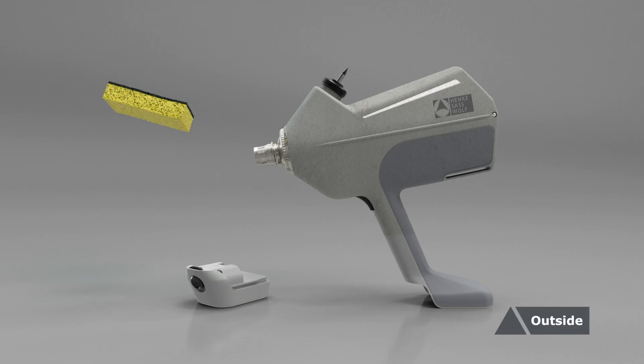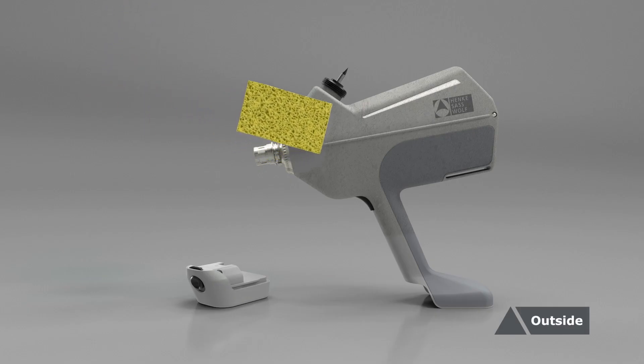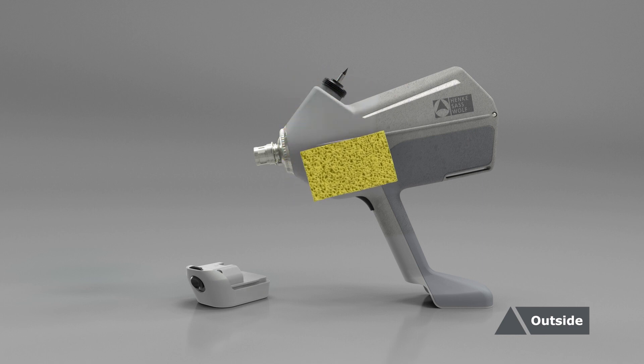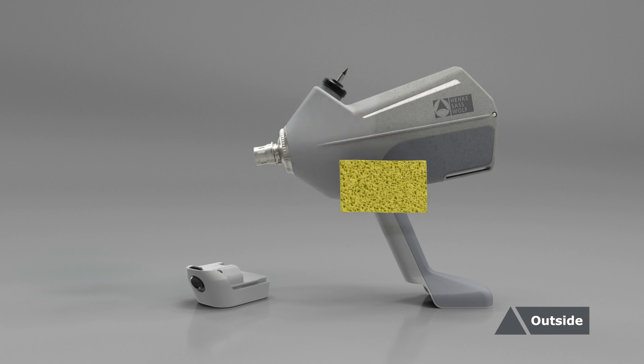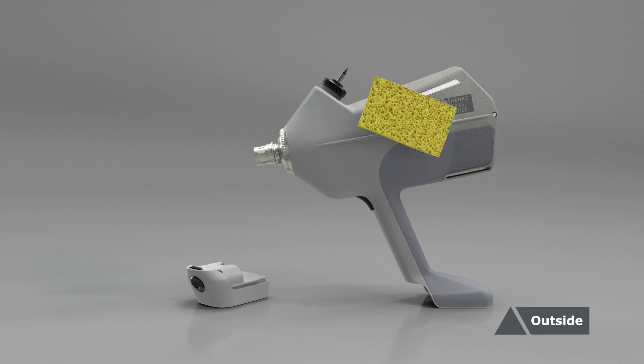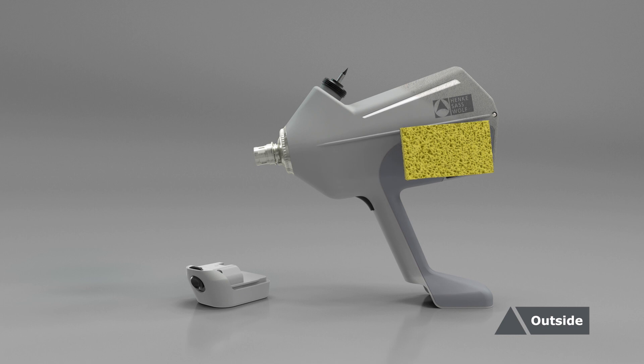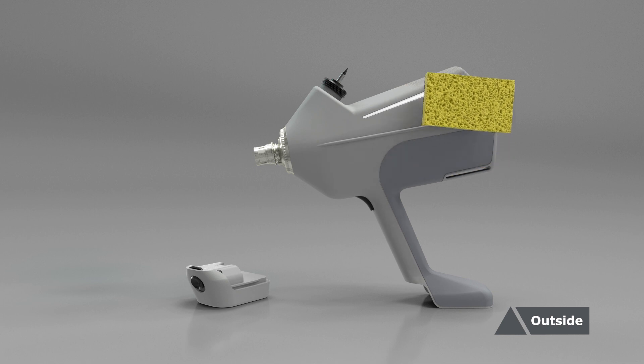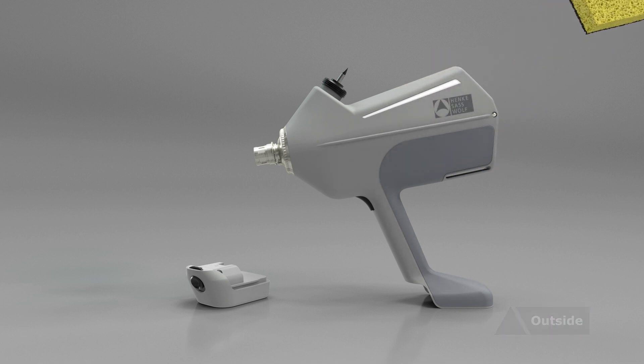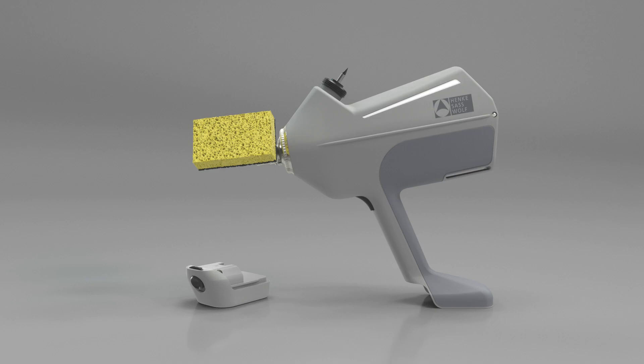To clean your device from the outside, follow these simple steps. Clean the complete device and the battery either by wipe disinfection or by using a sponge soaked with a water detergent mix.